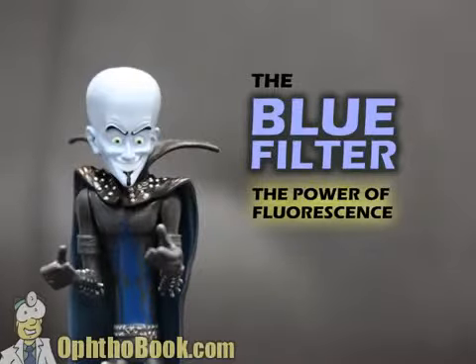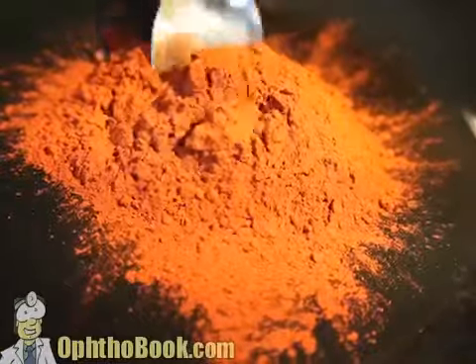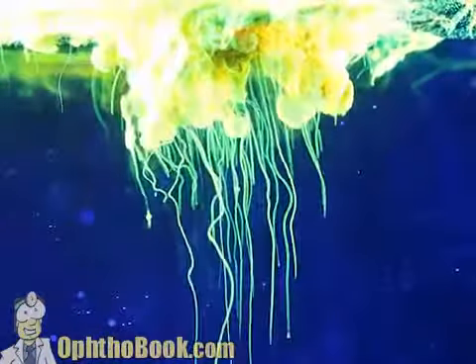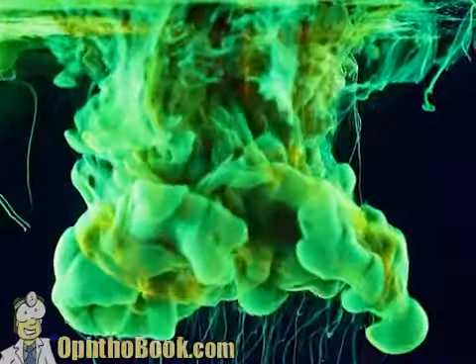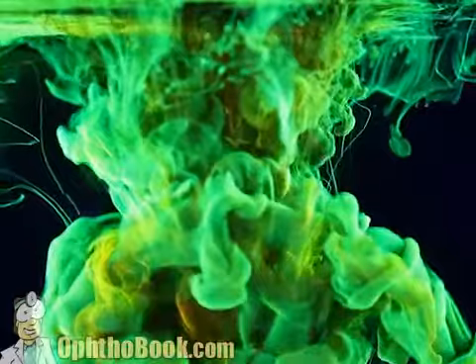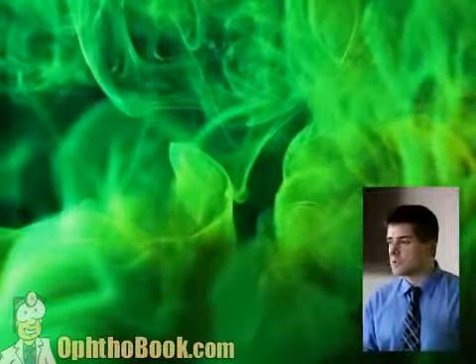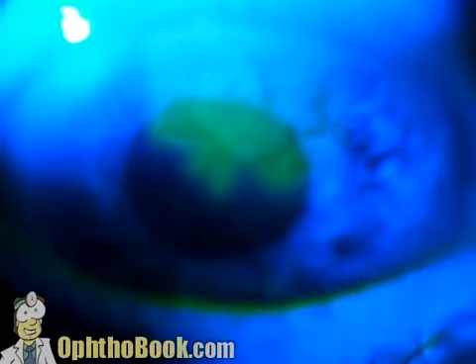And what is fluorescein? Fluorescein is a man-made organic substance that has a very unique characteristic in that it fluoresces. It's fluorescent, which just means that it will absorb light of one color, in this case blue, and it will emit light of a completely different color, in this case a kind of yellowish green. This has many applications, environmental studies, looking at hydrodynamics. It's also useful for tagging cells and cellular biology, but of course we use it in the eye for looking at things like a corneal abrasion, which may be hard to see with the naked eye, even using a microscope, but raw areas will uptake this yellow material and it'll glow under a blue light.